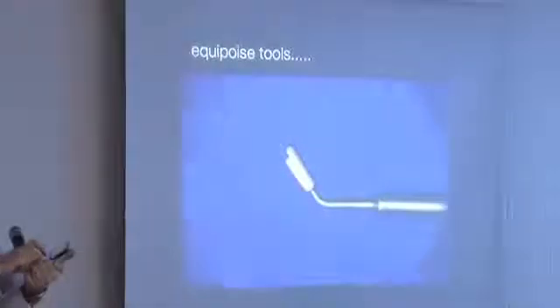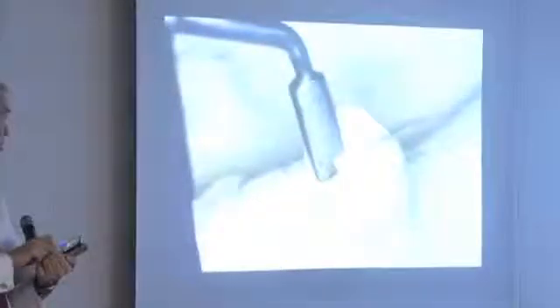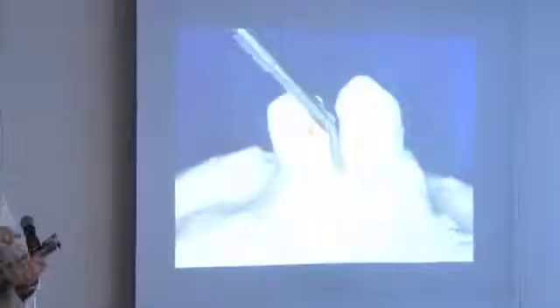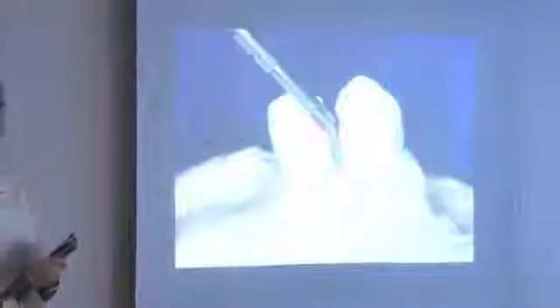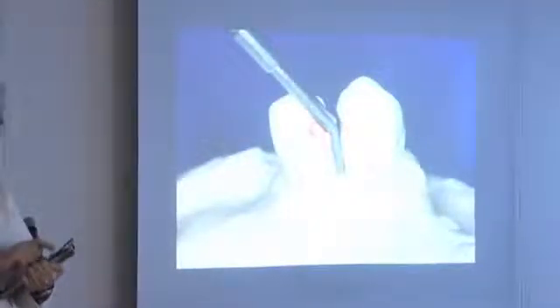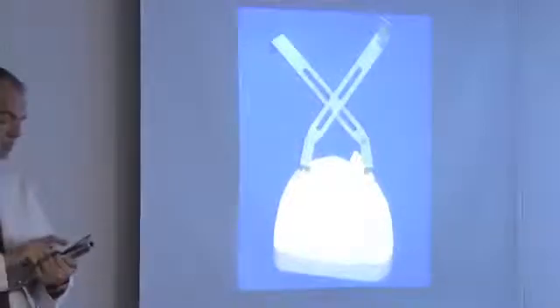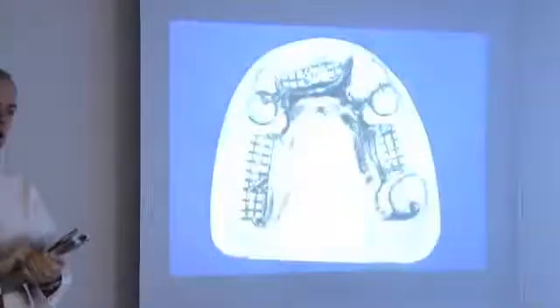The tip of this instrument is for measuring your rest seats, because that rest seat's 1.5 millimeters deep. Significant. I'll take a model just to show you that's how you measure it. The other end of the instrument is to get the space between the teeth. They have to be 1 millimeter. These guide planes have to be 1 millimeter thick. But how do you parallel them up? That's this instrument. You can take it all around the mouth and use it to parallel up these guide planes. And that's what you end up producing.